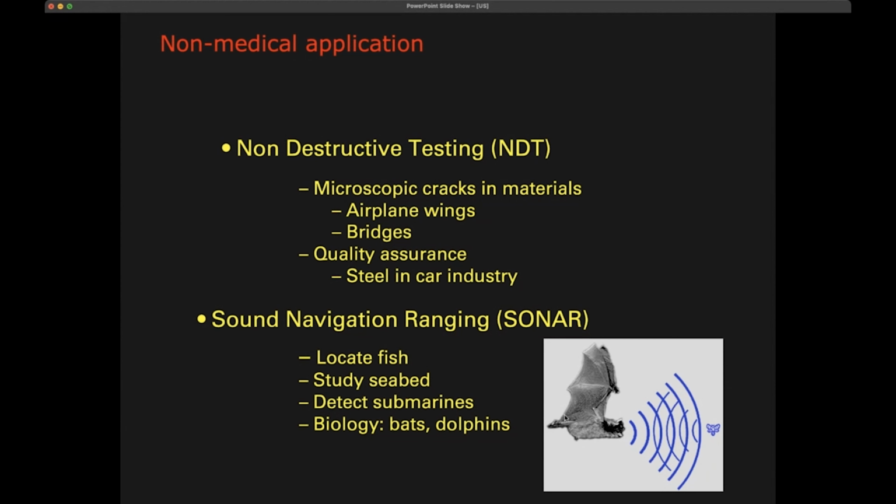So really trying to make a representation of, for example, the trees and the objects or insects that they're looking for around them. But what we'll see later on is that with ultrasound, we can not only look at tomography, so for anatomy, but we can also measure velocities, for example. And we do that using Doppler effects. And there are also bats, and it depends on the species, that are using this. So instead of trying to make an image of their environment, they try to make an image of the velocities of their environment.